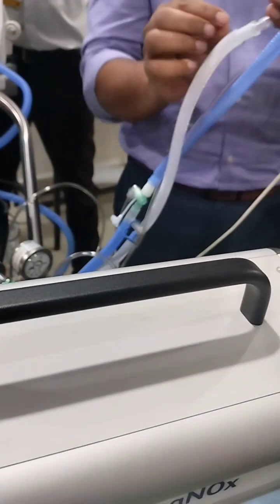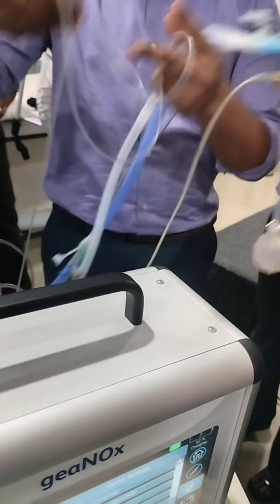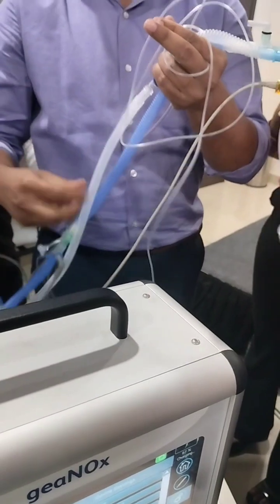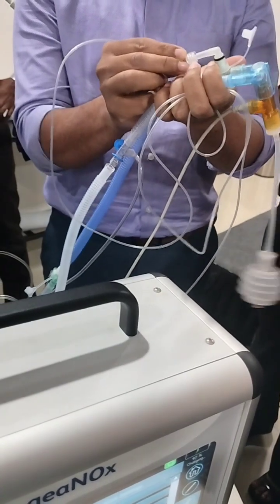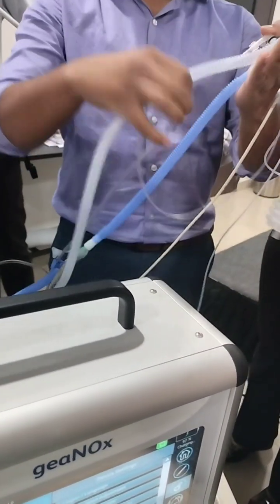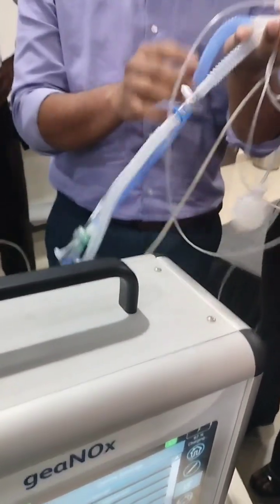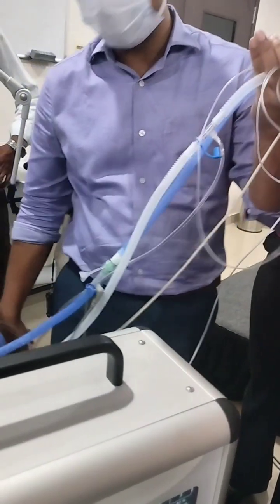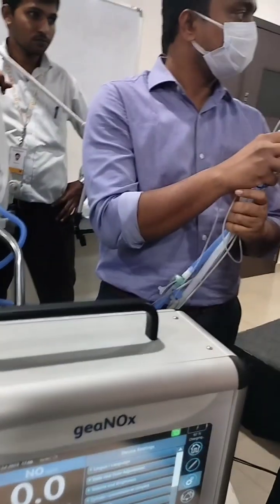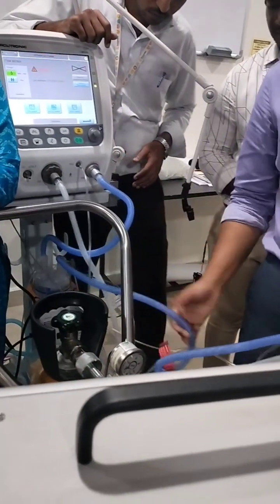Here you are measuring how much NO2 is being generated — this is the feedback. There is a water trap here, and this is the expiratory limb where you have the proximal airway. Both NO and NO2 are measured on the inspiratory side, and there is a proximal water trap here as well.